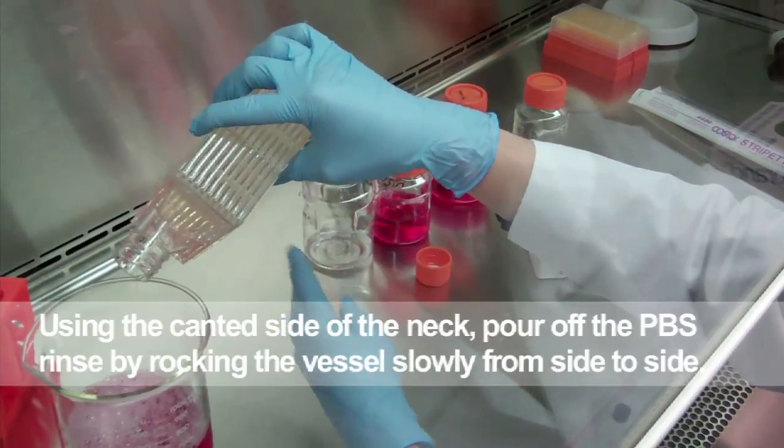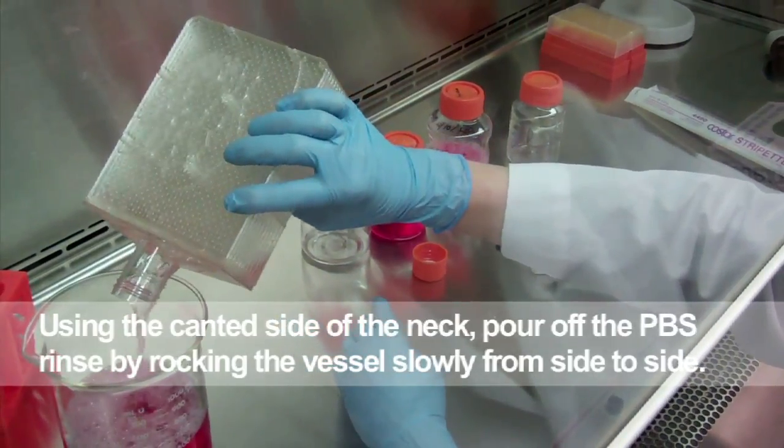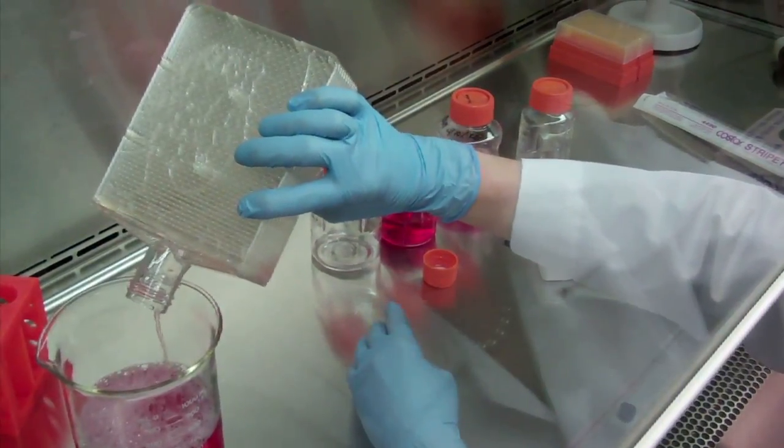Using the canted side of the neck, pour off the PBS rinse into a waste container, rocking the vessel slowly from side to side.